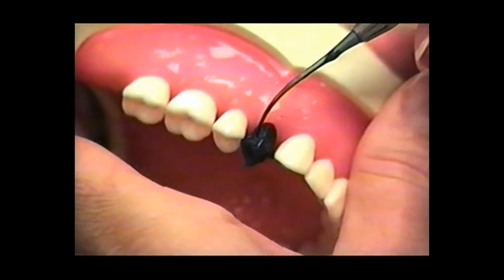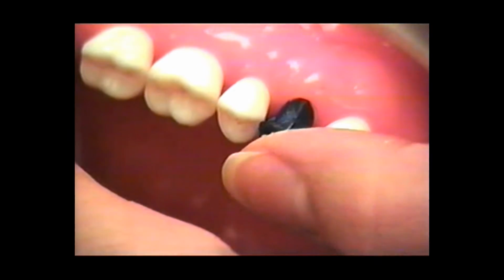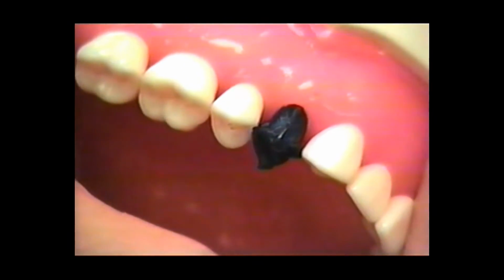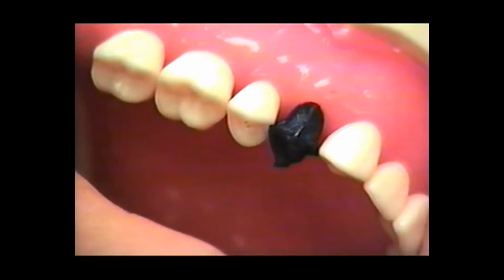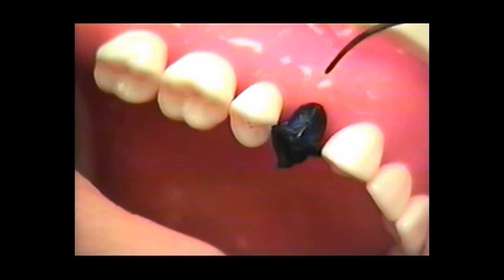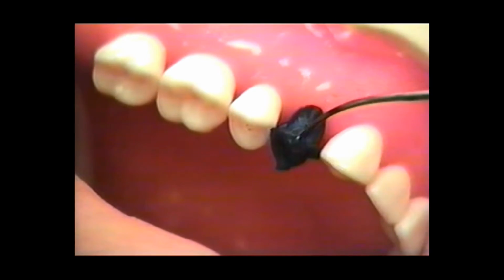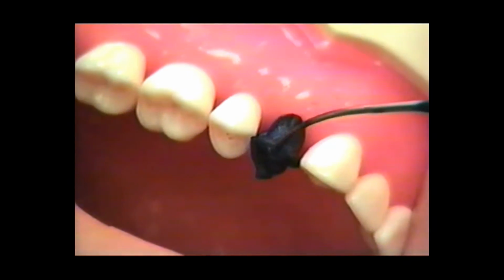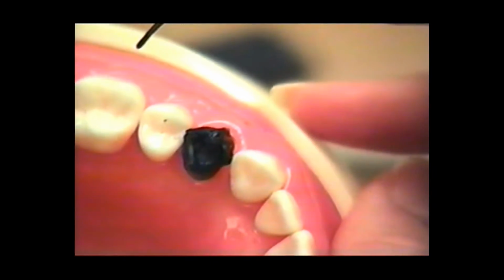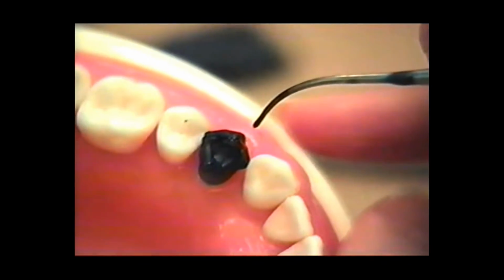And then you just fill in these areas here and here with wax, and you develop your embrasures. You might have to carve it back a little bit, and you do the same thing on the lingual. I know it sounds like, well, you just do it, and you need to practice. But if you first do your cusp tips, then do a facial contour, then do a proximal contact, cusp arms and marginal ridges, then you're pretty much there, and you just need to fill in the blanks, and you're going to have something that looks a lot like a tooth in a relatively short period of time.